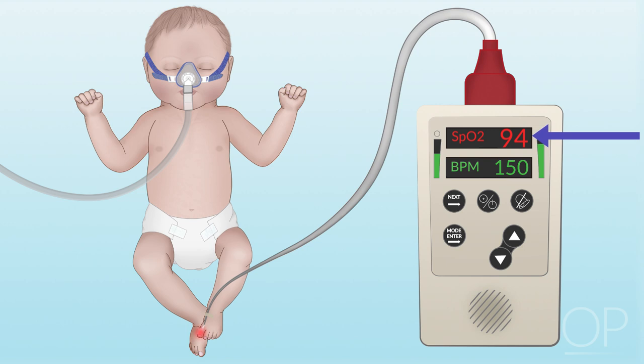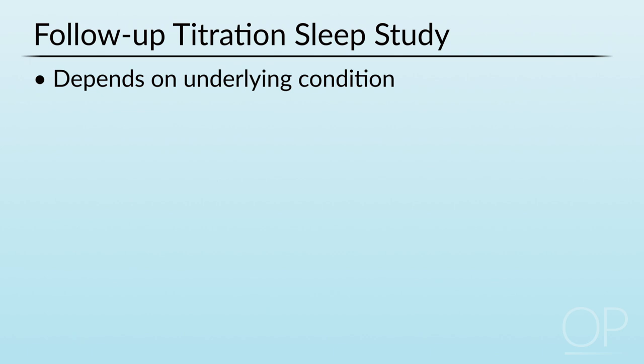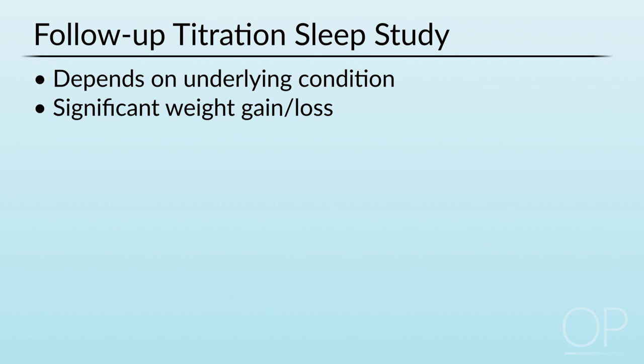What are the timings to follow up titration sleep studies? That depends on the underlying conditions and what you're treating. If somebody gains significant weight, say you have a patient you started on CPAP of 5 centimeters of water, the patient comes back after 1 or 2 years doing well, and you see that the patient has gained about 20 or 25 pounds, and now is either struggling to use CPAP or is snoring while on CPAP, indicating that he may need more pressure, in that situation, you may need to repeat the study.